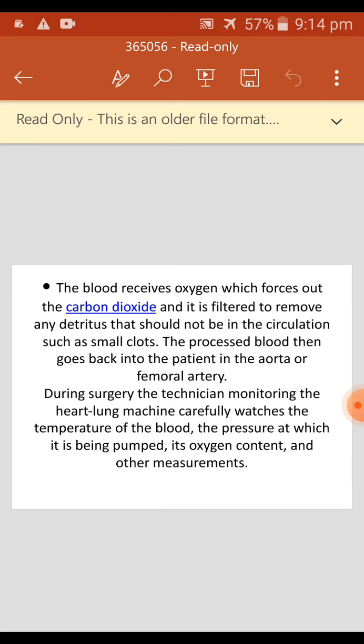Modern heater cooler devices feature several circuits with different temperatures. Heater cooler devices have always presented a hygiene challenge because the system parts that transport water inevitably become contaminated by germs.